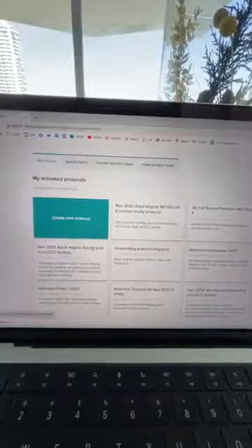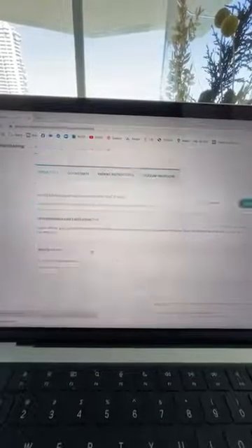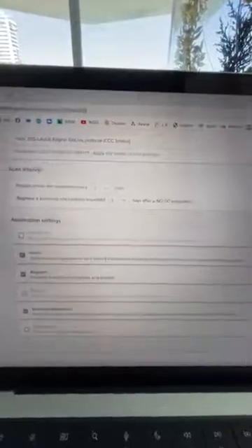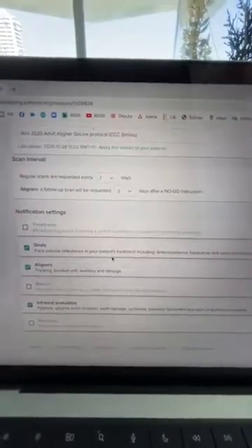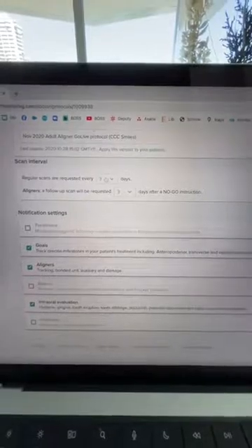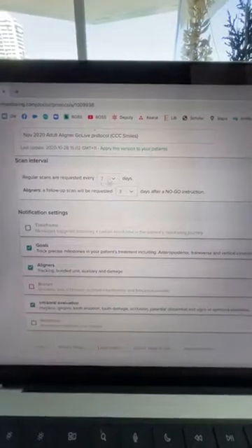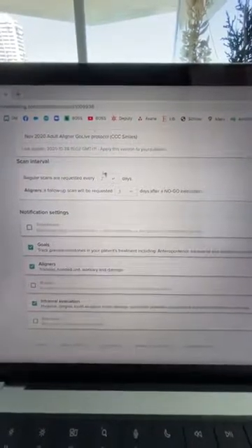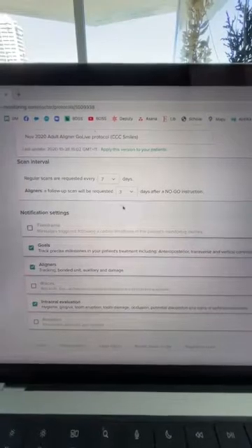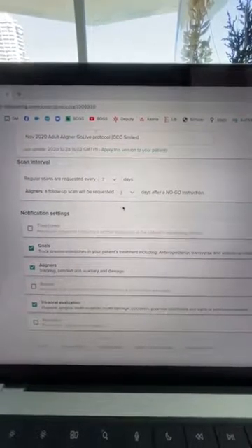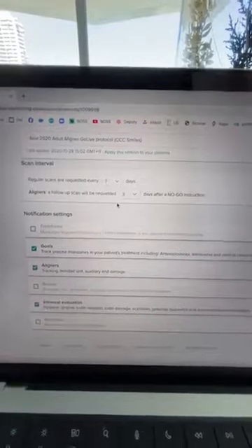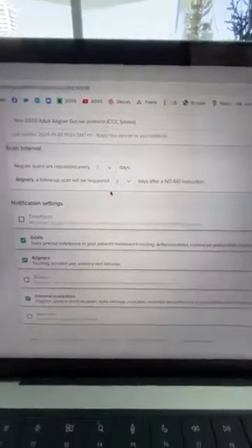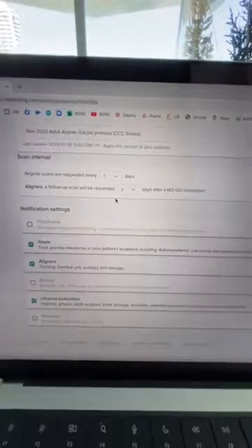Let's look at a practice aligner go-live protocol. What this protocol is telling us: how often we're going to request a scan from each patient. We said seven days. What if the patient is not ready to change their aligner at day seven? We said, well then we want to give this patient another three days and allow them to scan again.